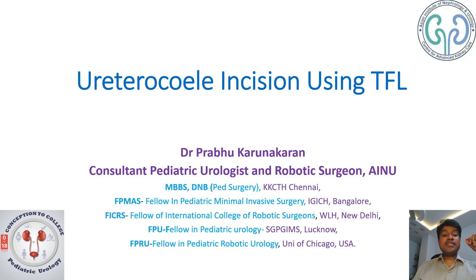Good morning. Today we are going to see a ureterocele incision using a thulium fiber laser. You are listening to Dr. Prabhu, a pediatric urologist at Hyderabad.